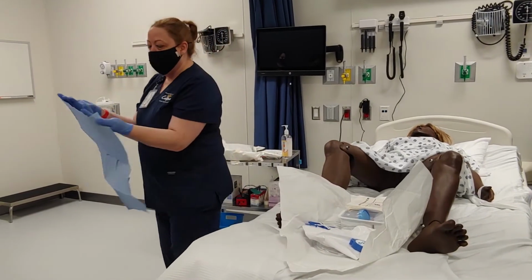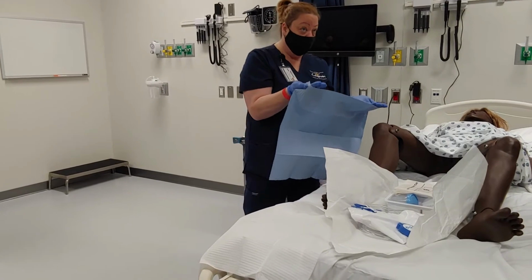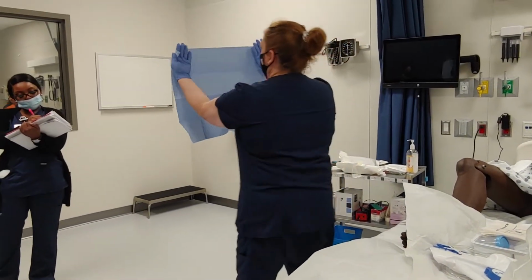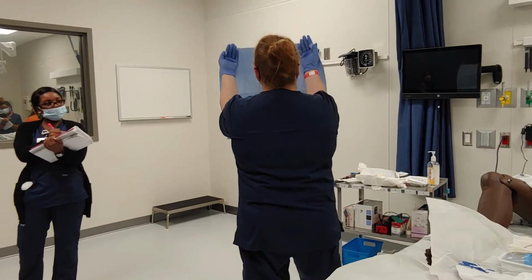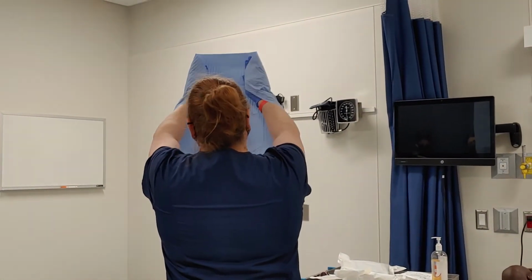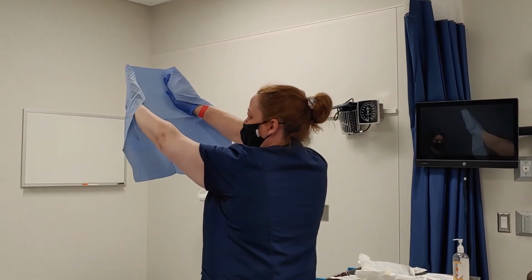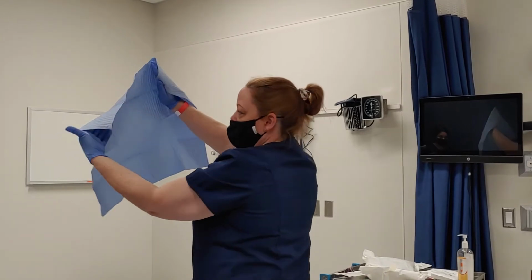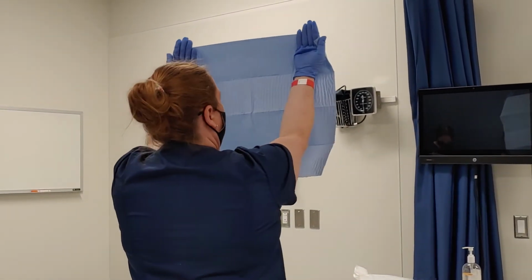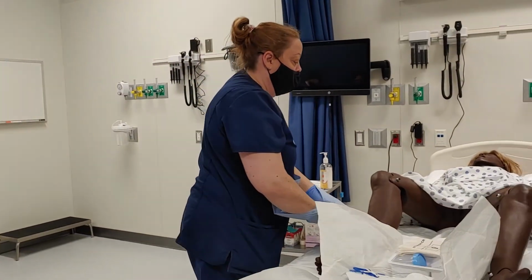Now, the way that I put this under them, I would be asking them to help lift up their hips for me, and I would slide this under. The way that we do this, we hold our hands facing us and hold the tab between our thumb and our finger, and we fold under. Then we're going to scoot it under their bottom and let it go. Okay? So one more time, we're going to hold it like this between our thumb and our index finger, fold it over. Can you help me lift them up?